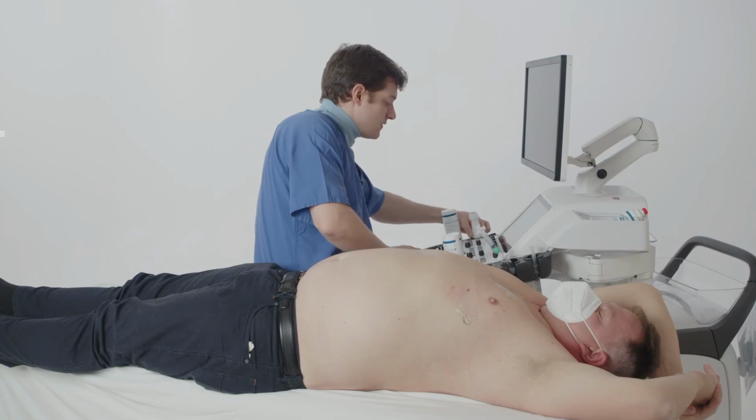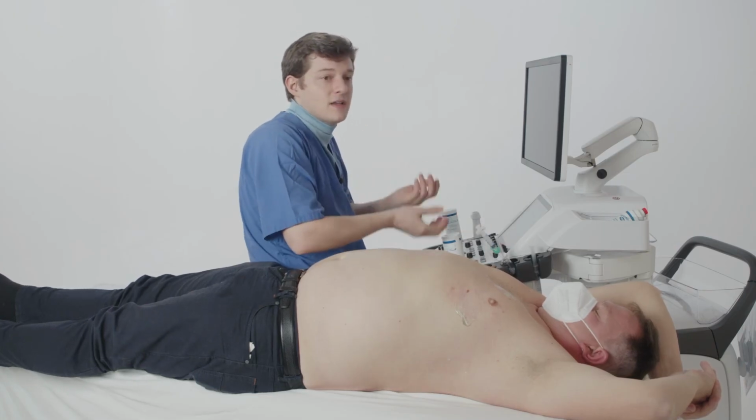So to summarize this imaging, we do have myocardial thickening. So in our evaluation, it turned out the patient has a hypertrophic obstructive cardiomyopathy.